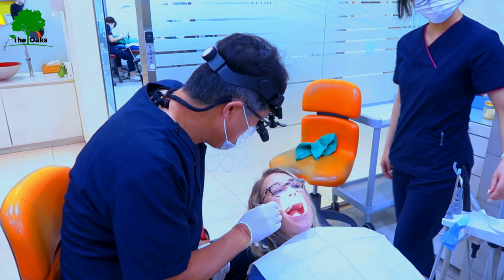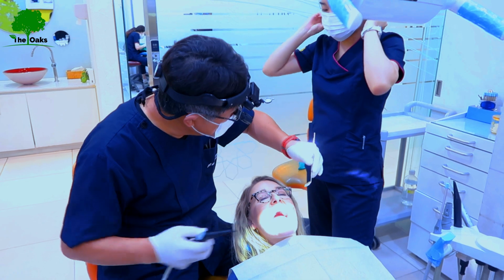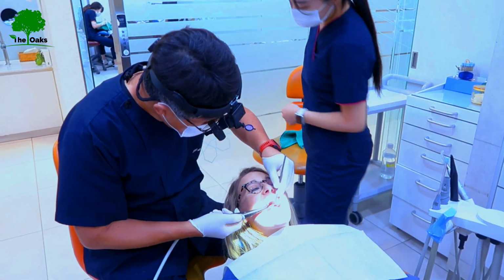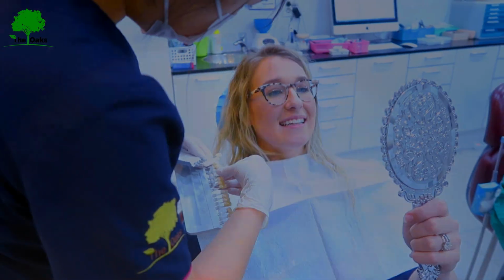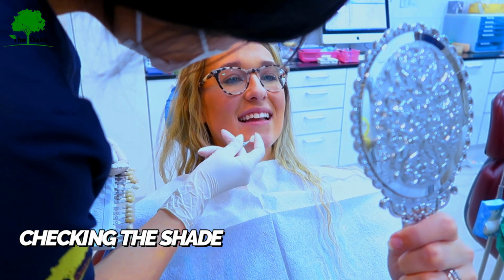During this discussion, our patient shares her concerns about the discoloration of her teeth and her desire for a whiter smile. Dr. Bay listens attentively, ensuring our patient's goals and expectations are understood before creating a personalized treatment plan. Now, let's take a closer look at the teeth whitening procedure itself.